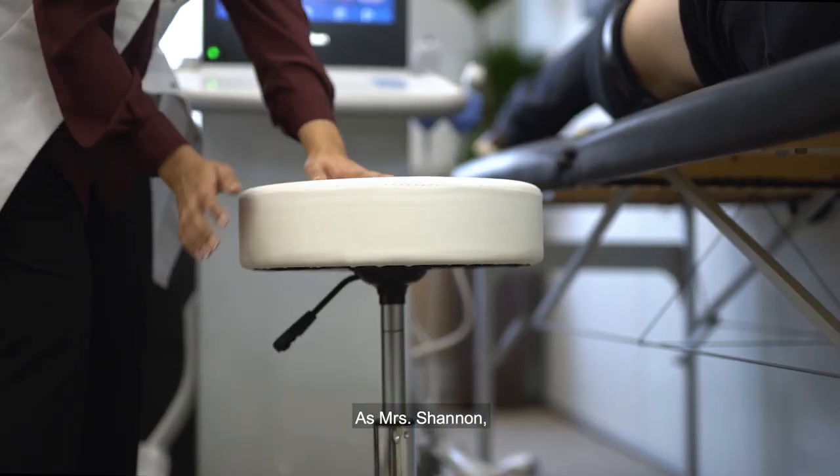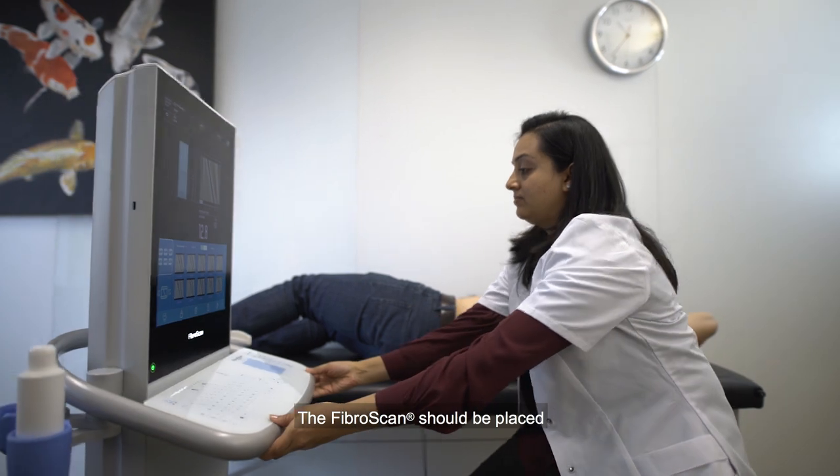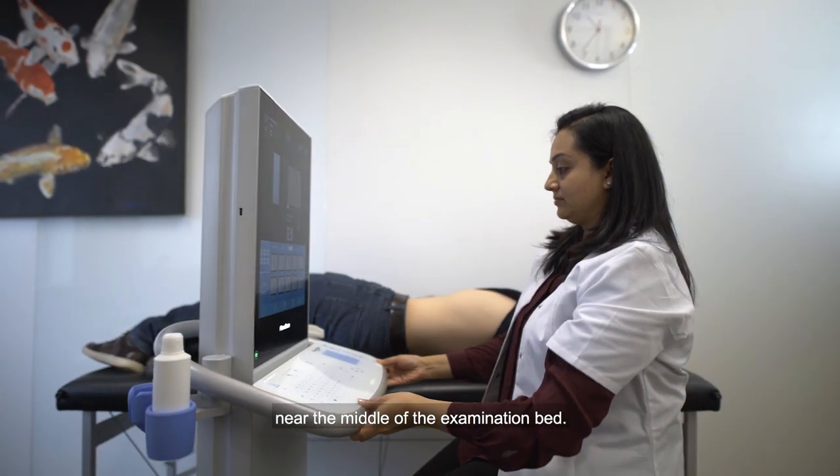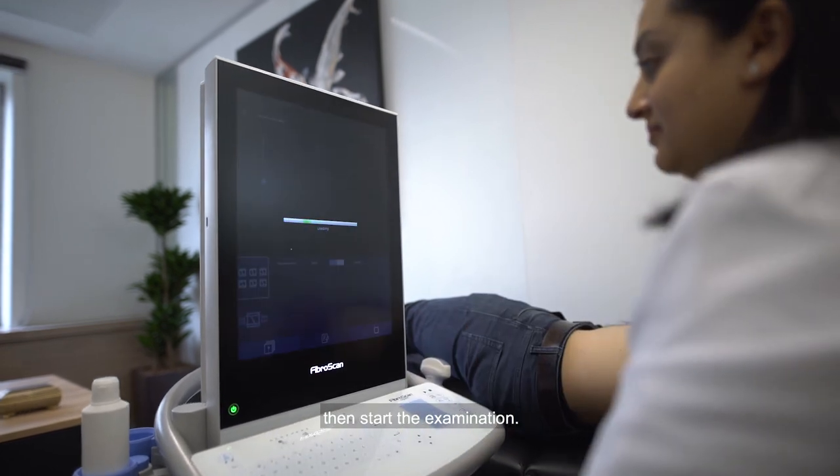Mrs. Shannon, you shall sit on a height-adjusted seat. The FibroScan should be placed near the middle of the examination bed. Select spleen mode on the interface, then start the examination.